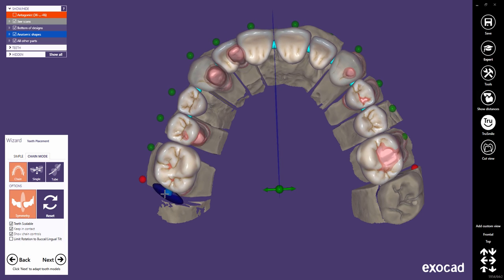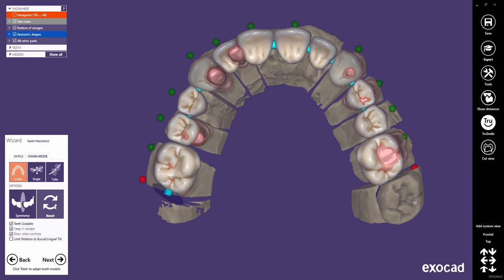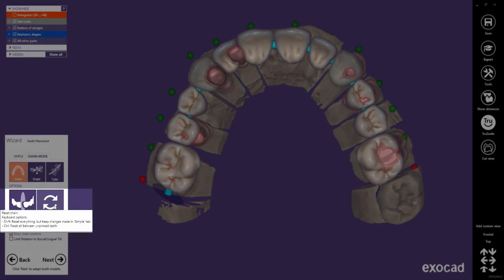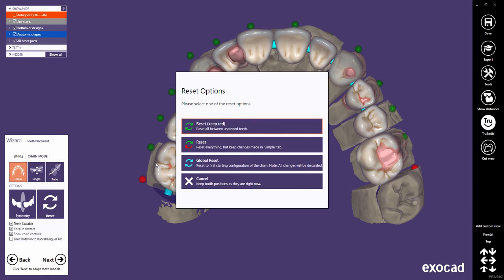The last option I want to show you is the reset button. This button allows you to reset your placement in different ways. The first option resets all teeth between unpinned teeth. The second option resets everything but keeps the changes made in the Simple tab.